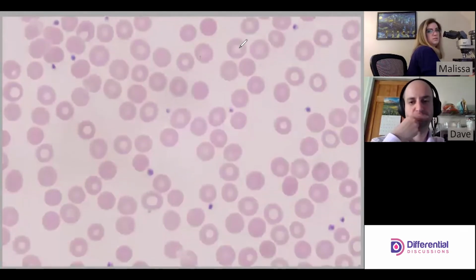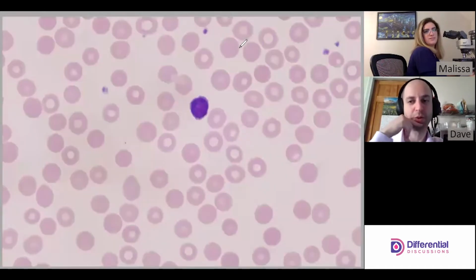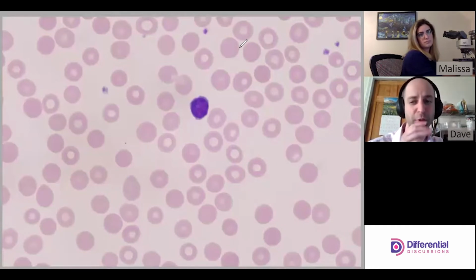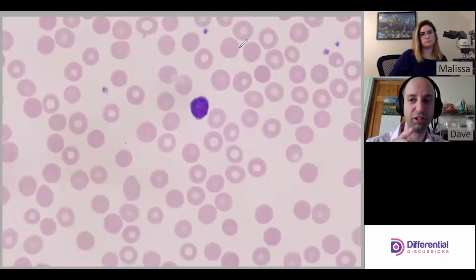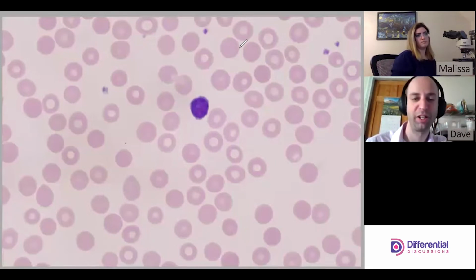Oh, all right, there's another one. Bring it back. I like this one. Not a lot of cytoplasm for this fella. We haven't come across a basophil yet. One thing I've noticed with low-level students first learning is they might see a basophil, which we haven't seen yet in this particular video. But basophils are packed full of purple granules. I've seen some people make the mistake of confusing a lymphocyte like this, with scant cytoplasm, with a basophil that's full of purple granules.